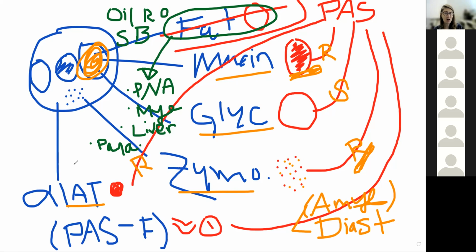Okay. The only other tumor that I can think of where fat is helpful, can anybody think of a tumor? Something that happens on the eyes. Eyes. Sebaceous carcinoma. Thank you, Fuad. So tell us about sebaceous carcinoma.